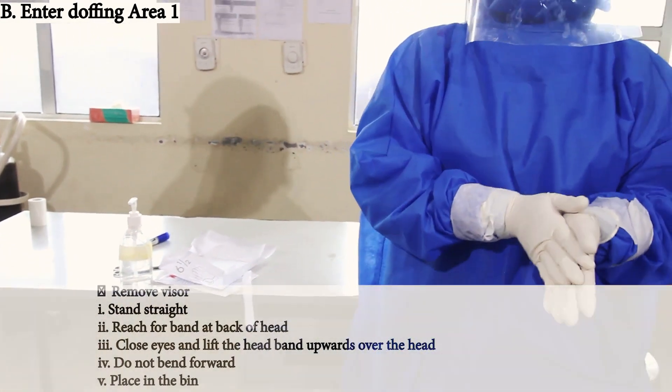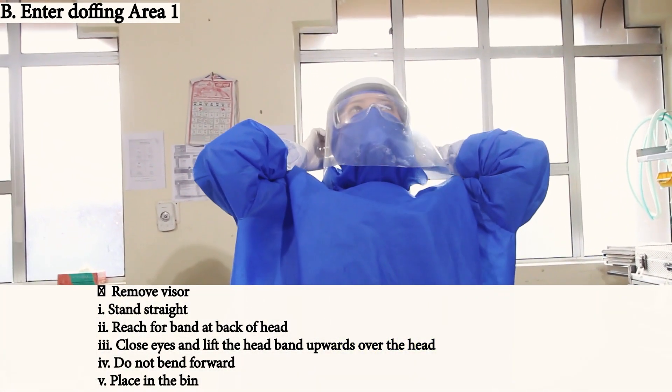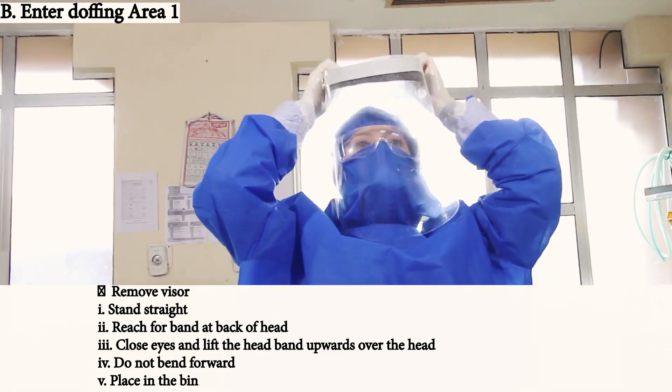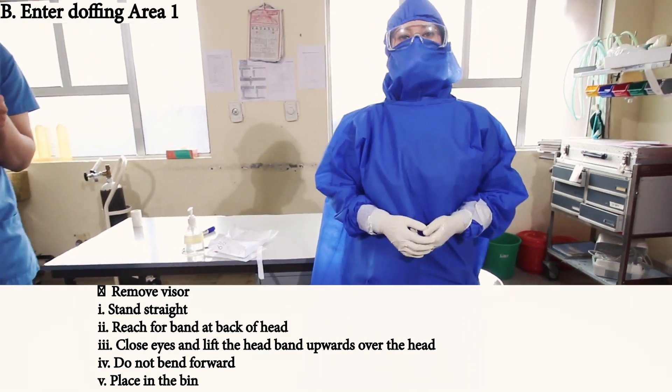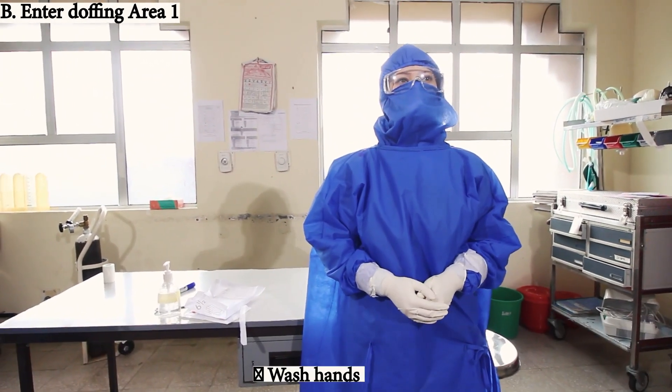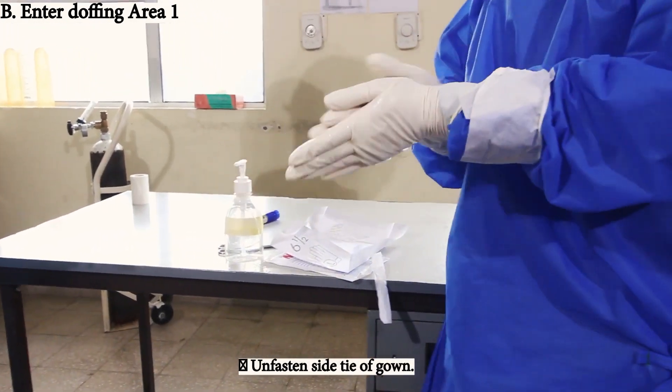Remove the visor now. Stand straight, reach for the band at the back of the head. Close eyes and lift the headband upward over the head. Do not bend forward. Place it in the bin. Now wash hands again and unfasten the side of the gown.